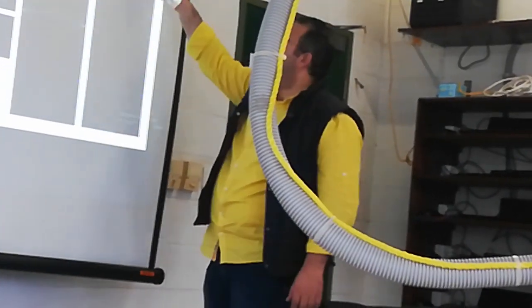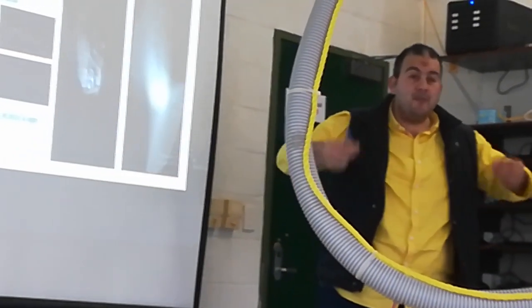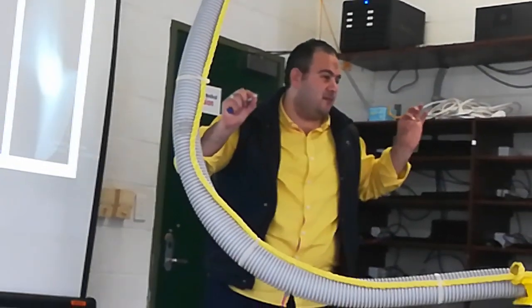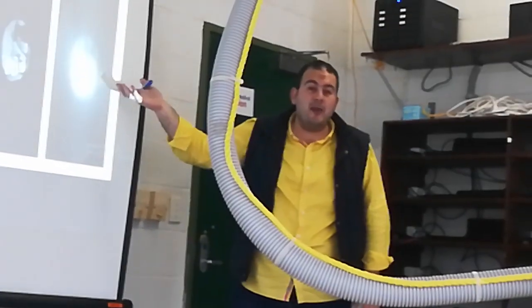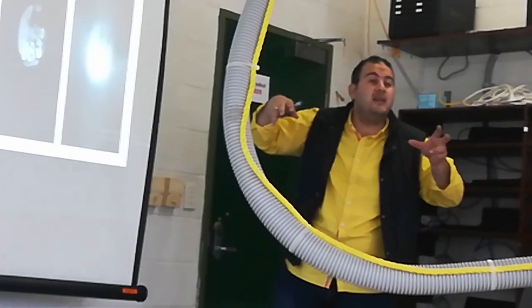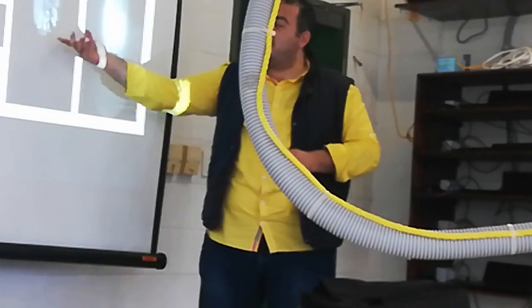This is image reconstruction. As you can see, this is called filtered back projection and the raw back projection. The standard reconstruction algorithm used for CT image reconstruction is called filtered back projection. This is the raw material of the image, a raw image without filtering, and this is the image after filtering. Filtering removes all frequencies or signals that I don't need, to finally get the image.